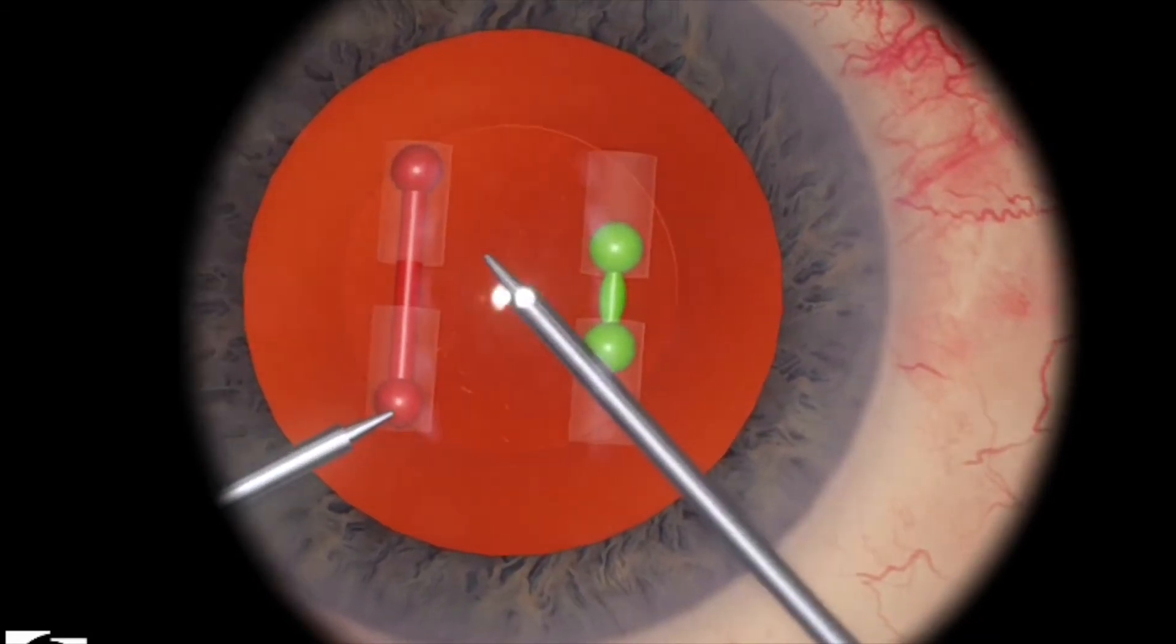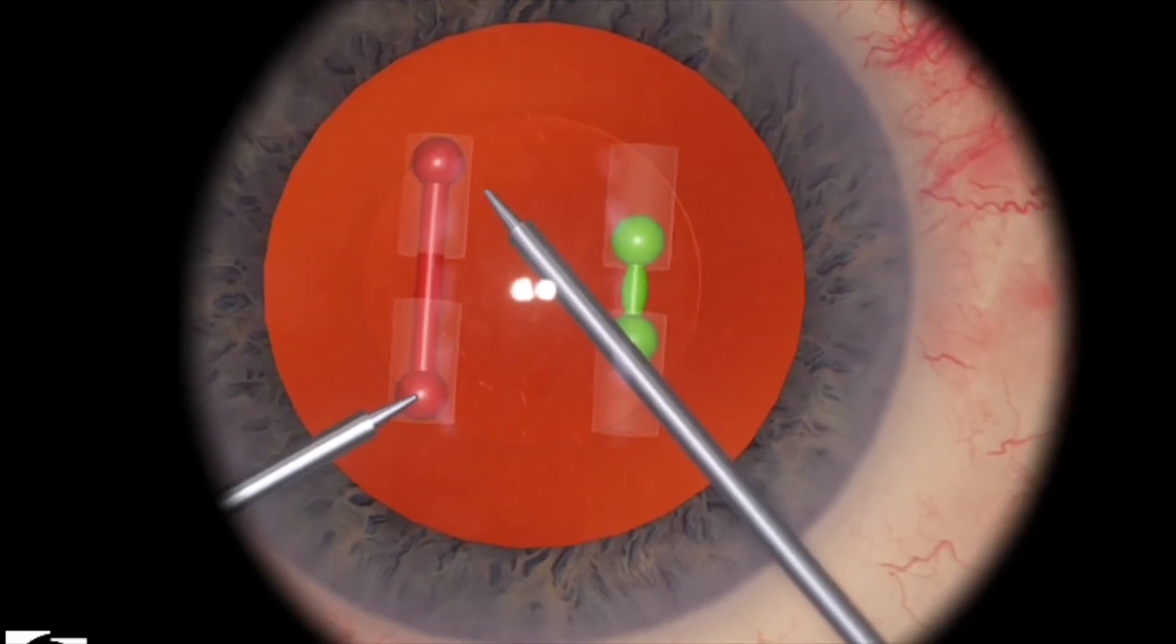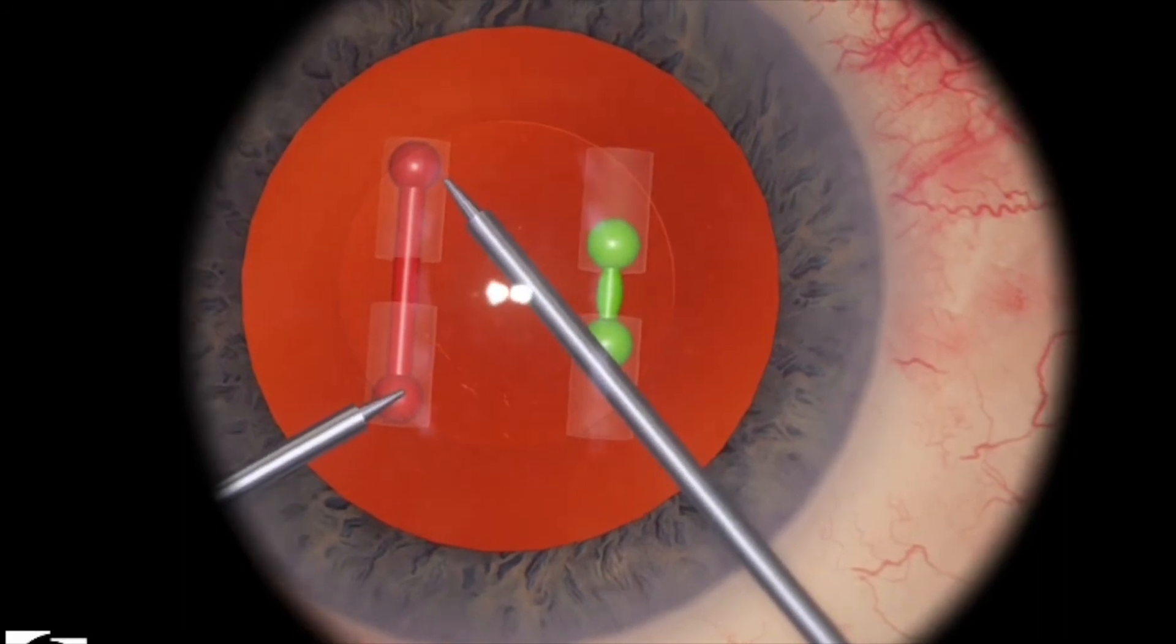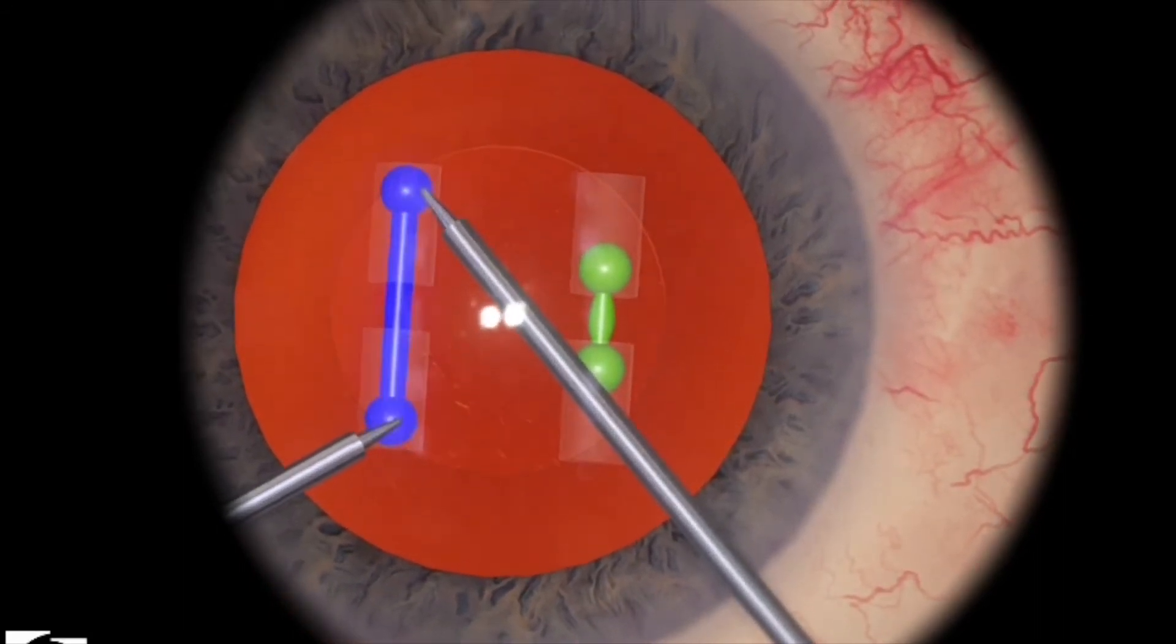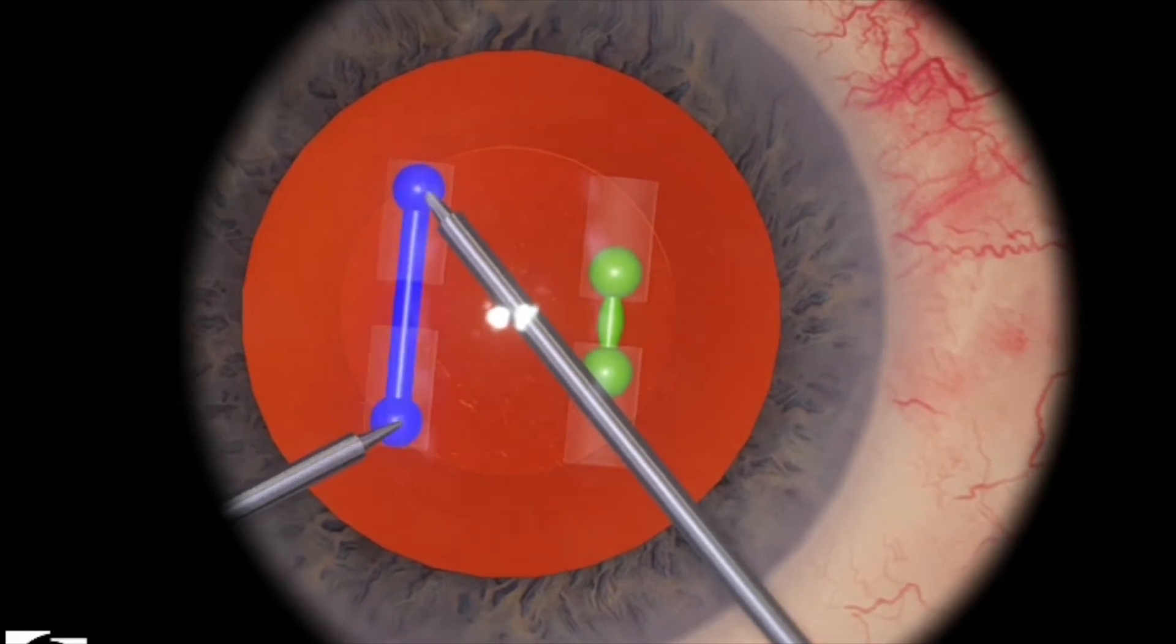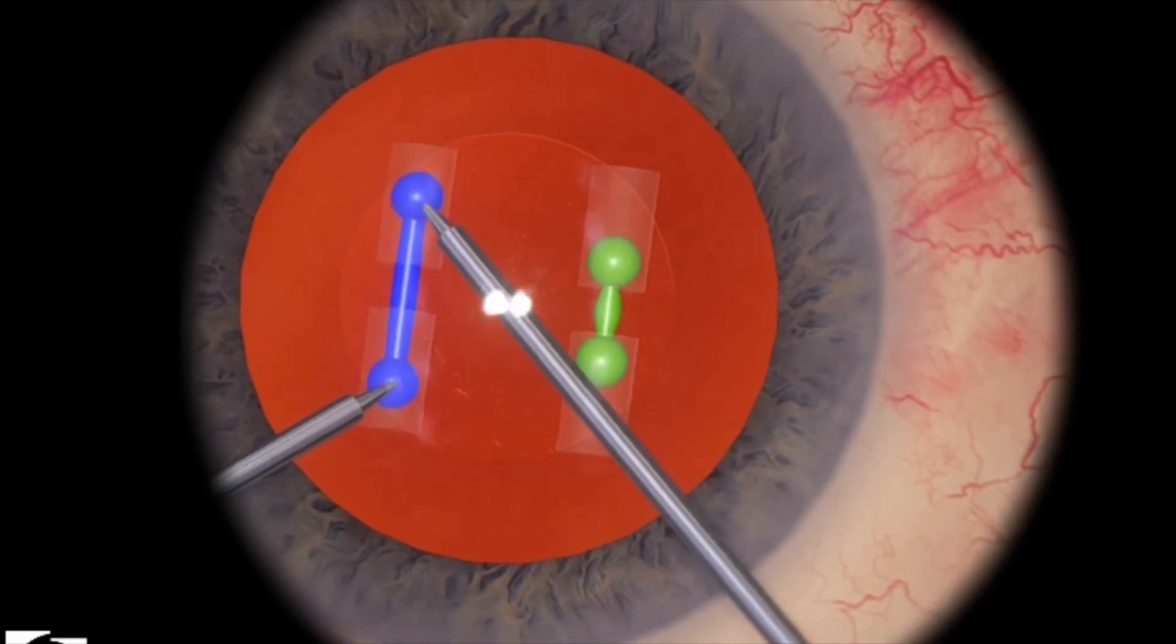I like putting the bottom sphere to my left instrument and the top sphere to my right instrument, but I am right-hand dominant, so maybe people who are left-handed might have a little bit of an easier time.